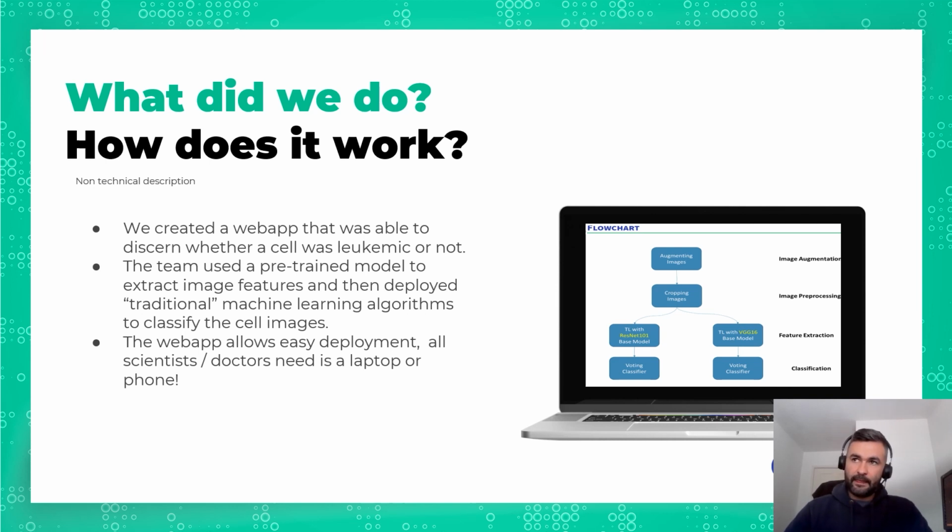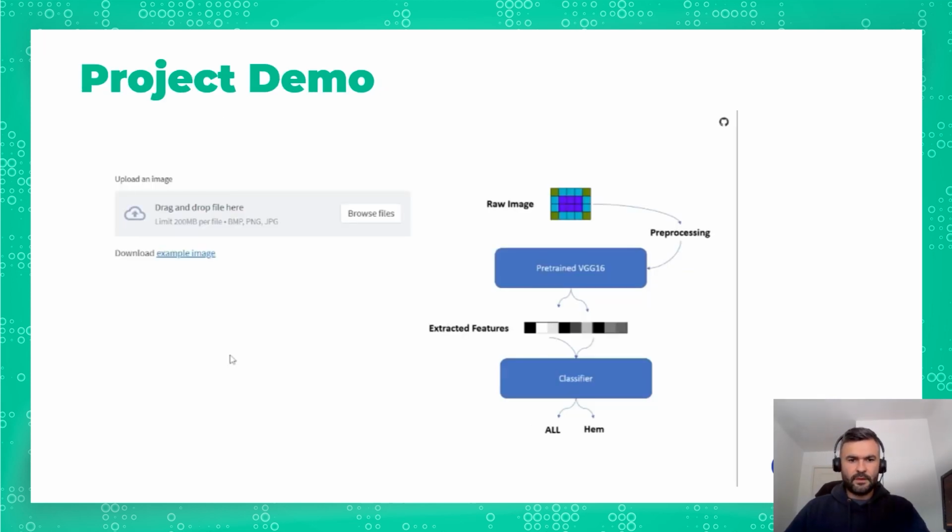The web app basically allows anyone to use it. It allows easy deployment in a hospital or a lab within the developing world. All you need is a laptop or a phone. And allow me just to demonstrate a little demo video.